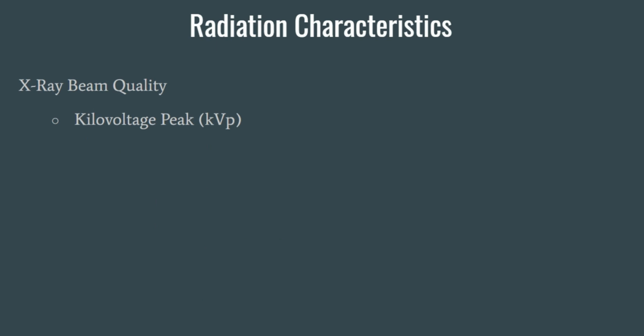So kilovoltage peak, kVp. You might hear this just as kilovoltage or just kV, but what it is, it's the maximum or peak voltage. What is the highest amount of kilovolts that you can use to get that image the way it needs to look?